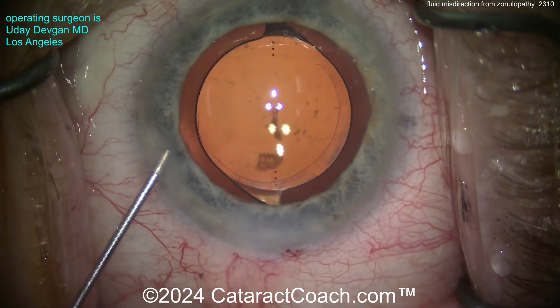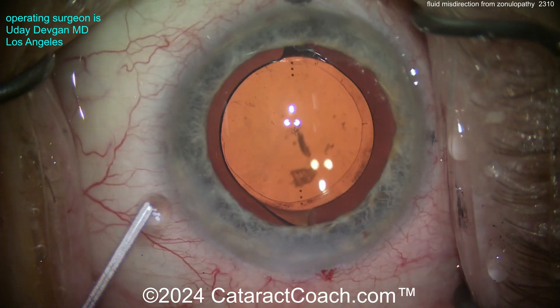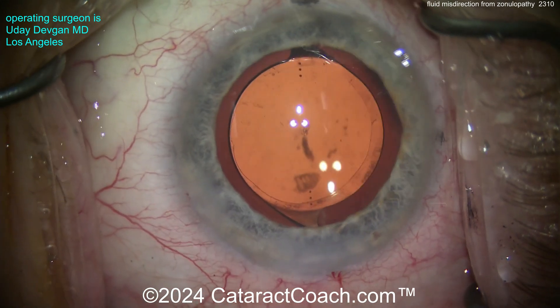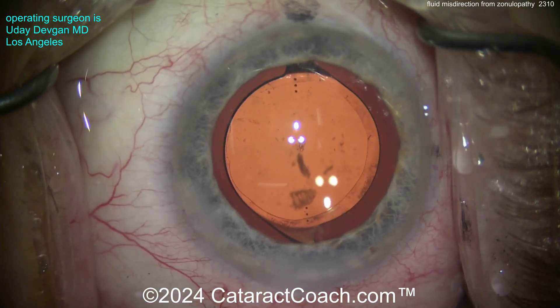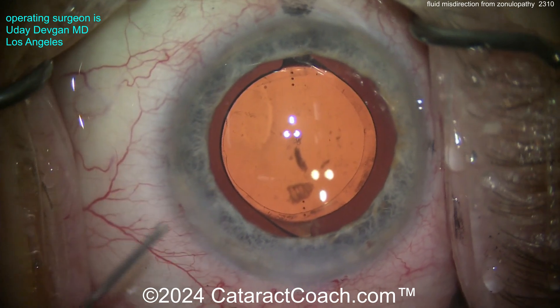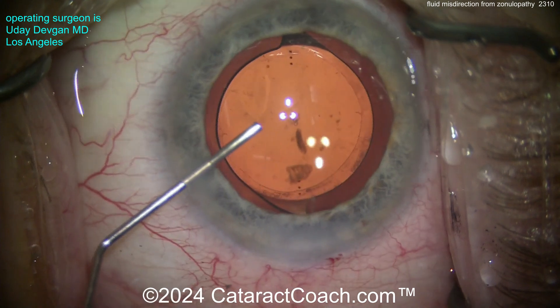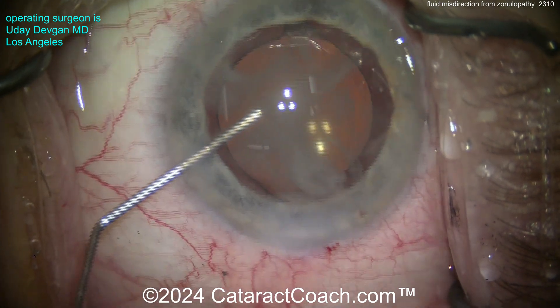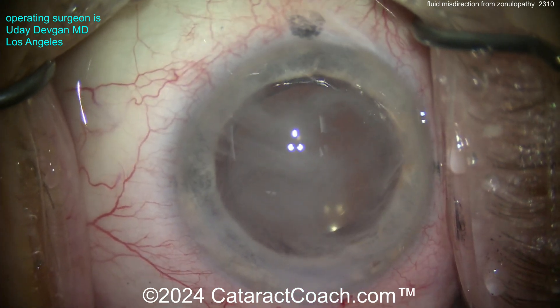If you're wondering how to get preservative-free triamcinolone when you only have the preservative-containing version, there's a video on cataractcoach.com where you can search for the word triamcinolone and learn how to wash it to get the preservative out. And there's the triamcinolone.